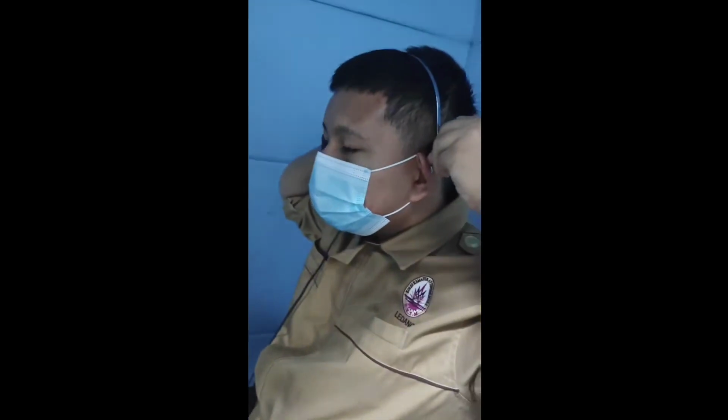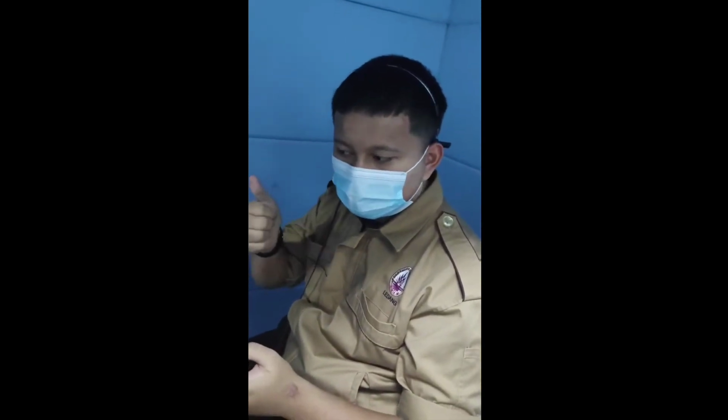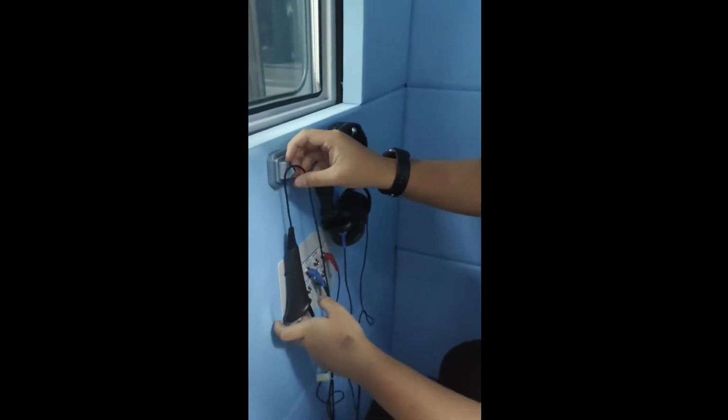For the bone vibrator, the position is at the mastoid bone. When the assistant gives the tone, the subject will press the button when they hear the tone sound. This test we do part by part.